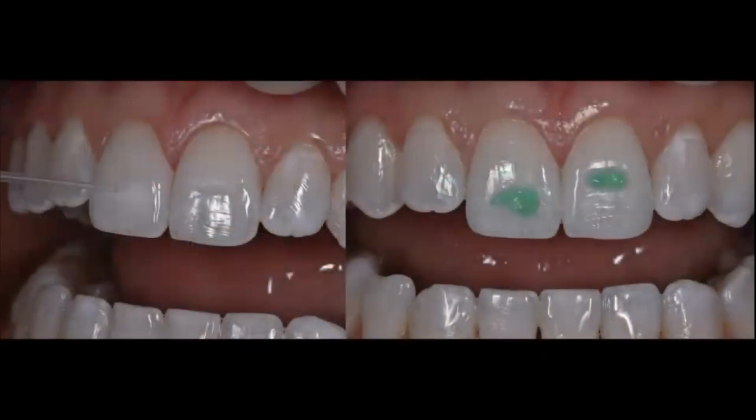Rinse and dry. Apply the Icon Dry, which is alcohol. You apply it on top of the white lesion. The idea of this is that you're going to eliminate all the water that is in those enamel prisms that are etched at this point, and they're deeply etched. And the other goal is that you do not want to see the white spot anymore. If you can still see the white spot, you continue etching. I would say maybe 30 seconds.